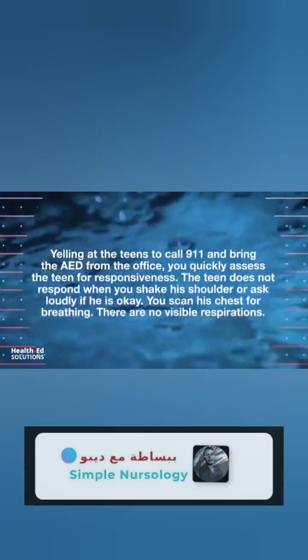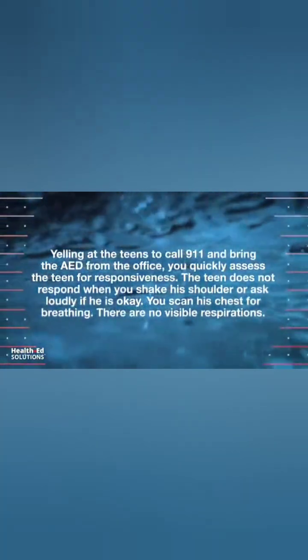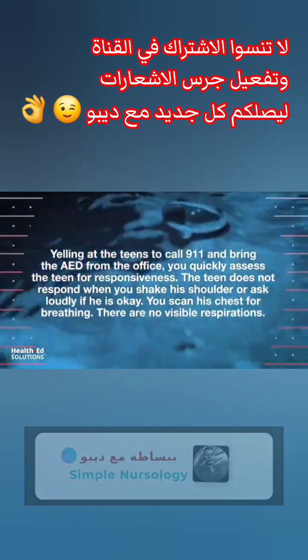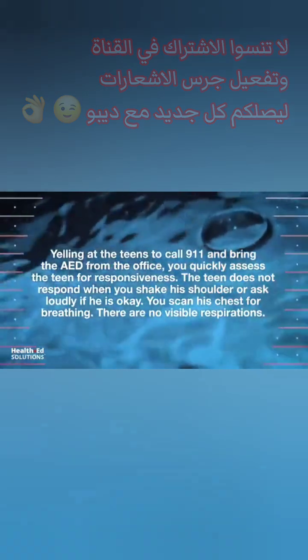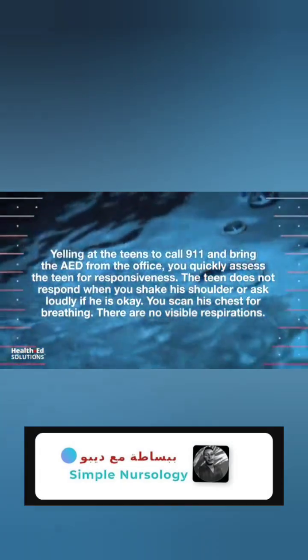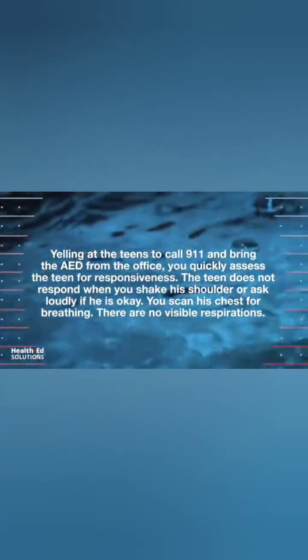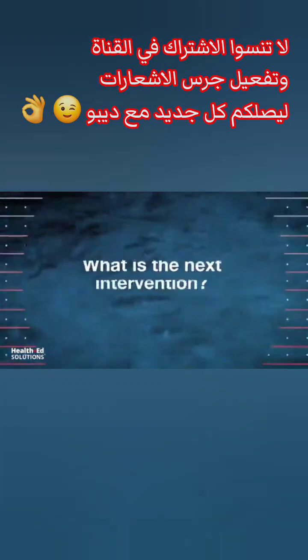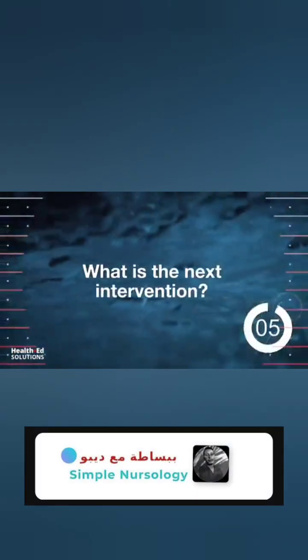Yelling at the teens to call 911 and bring the AED from the office, you quickly assess the teen for responsiveness. The teen does not respond when you shake his shoulder and ask loudly if he is okay. You scan his chest for breathing. There are no visible respirations. What is the next intervention?